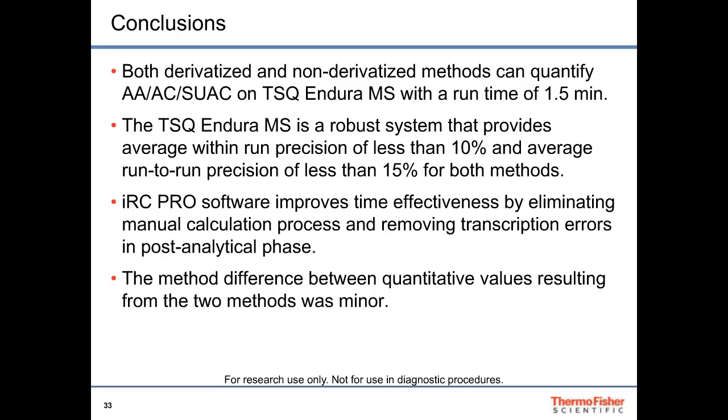Our first question is, do the two quadrupole mass filters, Q1 and Q3, have the same polarity or alternated? For either the Q1 or Q3 quadrupole mass filter, each one basically has 4 rods, and these 4 rods actually have 2 pairs of polarity, positive and negative. So that means each quadrupole has these 2 polarities.